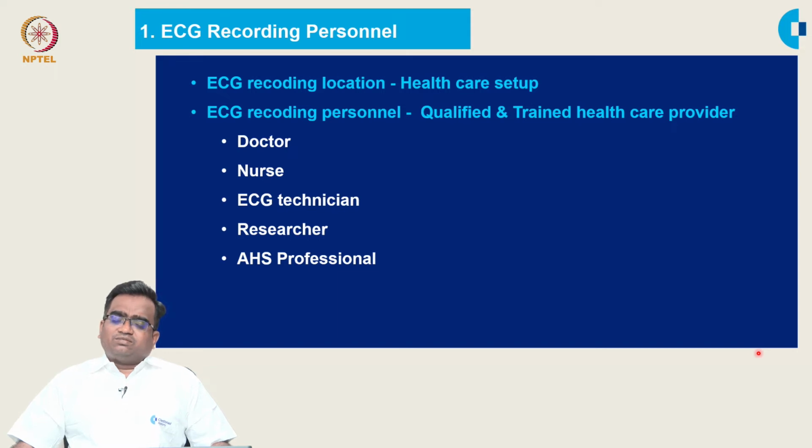The personnel may be a doctor, a nurse or an ECG technician, or a researcher, especially those involved in ECG related research activities, and allied health professionals. So, these healthcare providers can record ECG with proper training and expertise in the recording techniques.